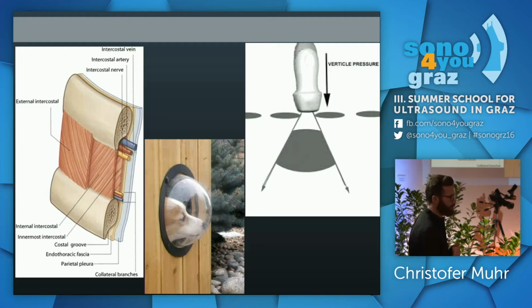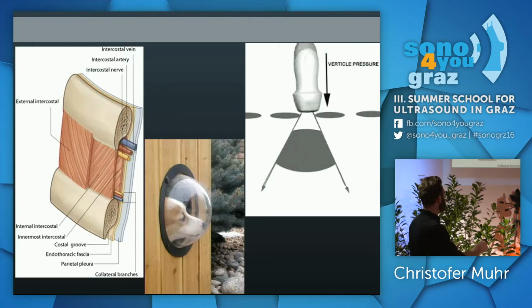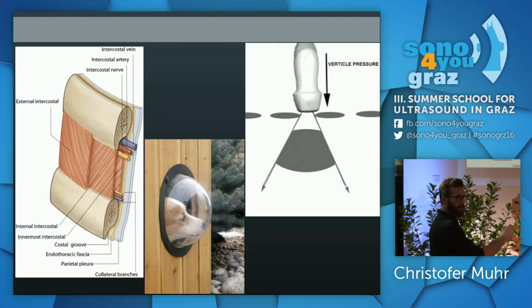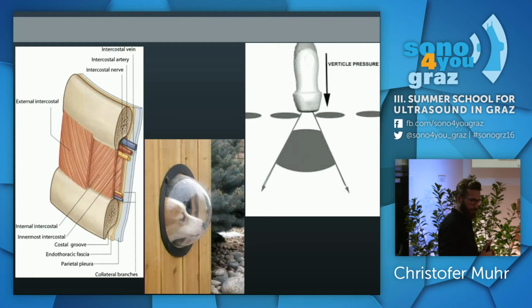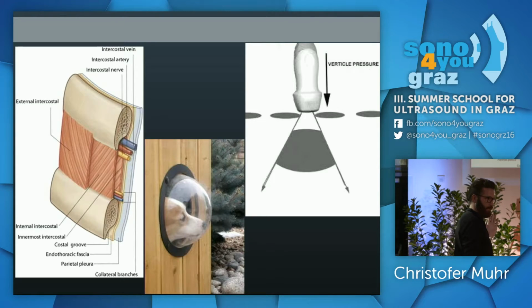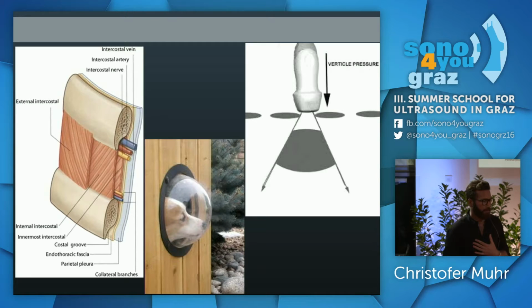how they look. So usually, a way to get a really nice view, especially an apical view, is to stand on the rib below and then just look up like this. Just tilt the probe and look up, because the heart is so close to the chest wall, right? I think you notice that now when we're scanning. It's hard to get the perfect angulation and open up all the rooms of the heart. So think about that. Slide down, stand on one rib, look underneath, and work with it. It doesn't have to be perfect if the patient's completely on the left side. Sometimes it's better if they're like this, or might even be on the back.